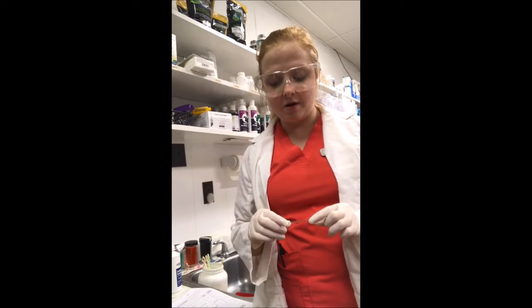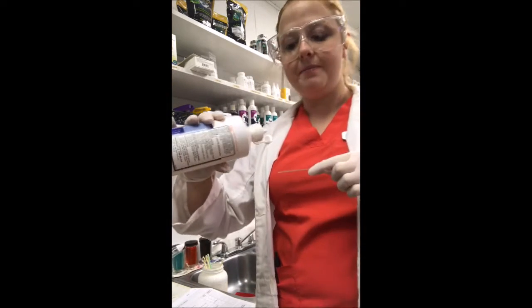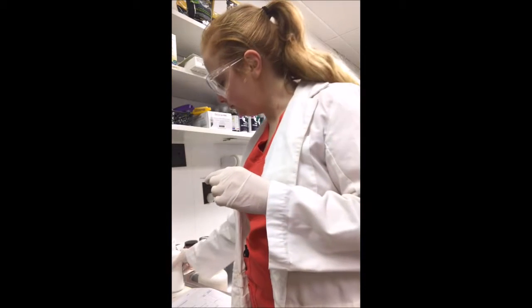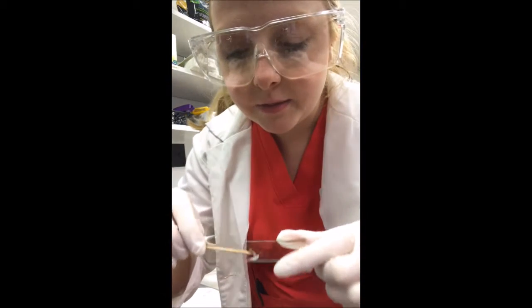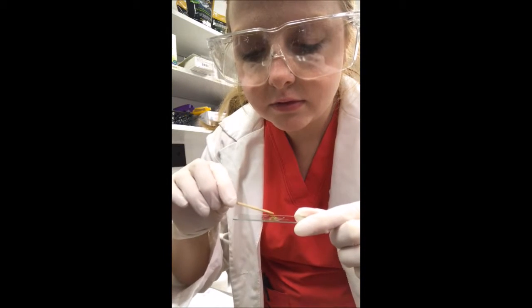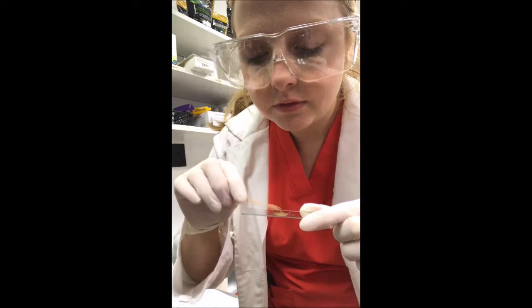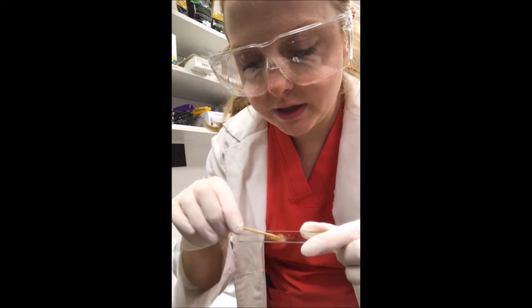Okay, so we're going to film our fecal direct smear. I have a slide here. I'm going to place a drop of saline onto the slide. And then I have a little bit of feces. And what I'm going to do is mix it up in here. Mix it really well. So you want it good and thin.